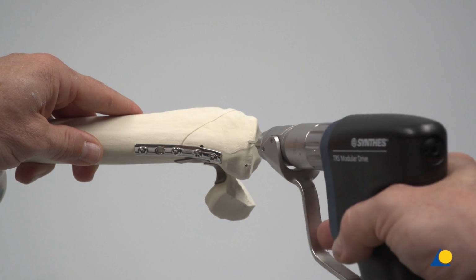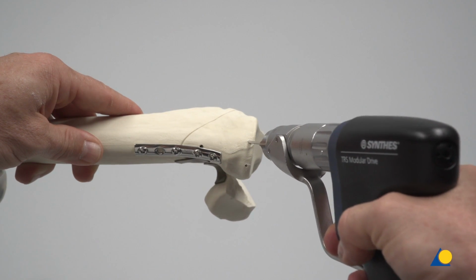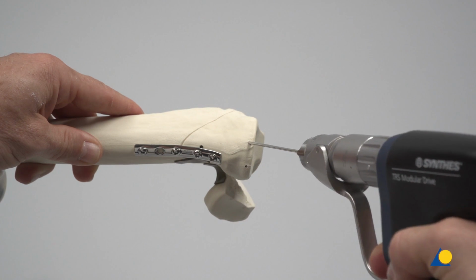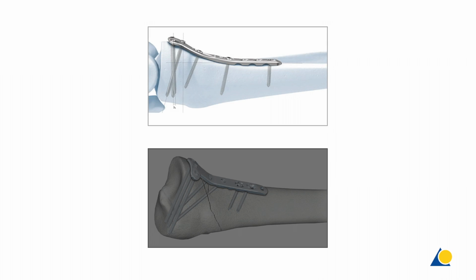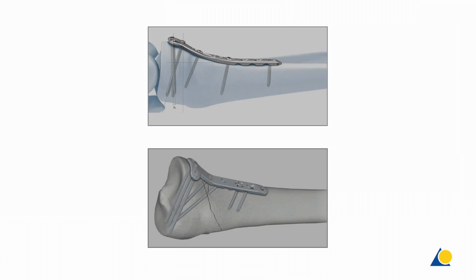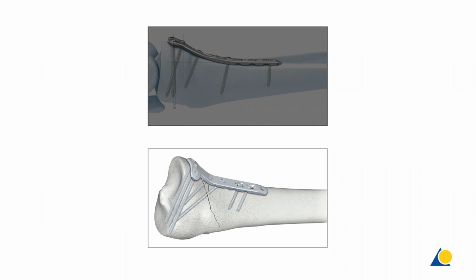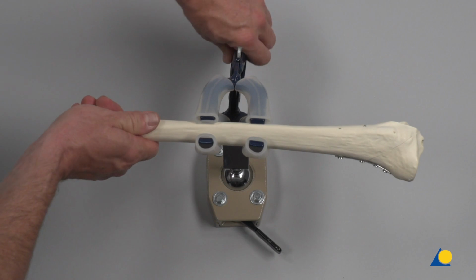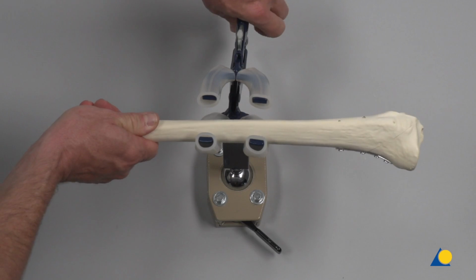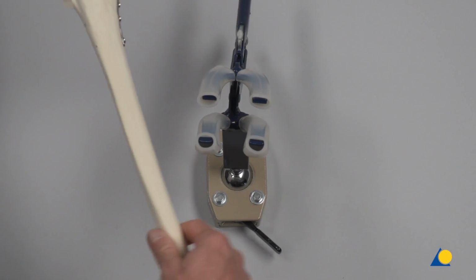Clinically, the reduction and reconstruction of the medial plateau would be verified under image intensification. Note that, depending on the fracture characteristics, different plates can be used medially. For example, the posteromedial or the medial 3.5 mm LCP plate. At this point in the demonstration, the bone model is rotated 180 degrees to access the lateral plane.